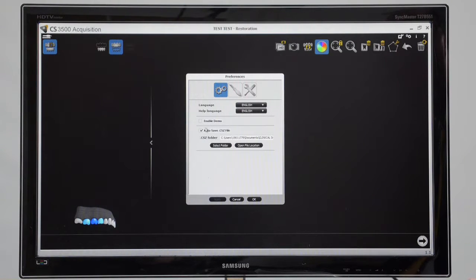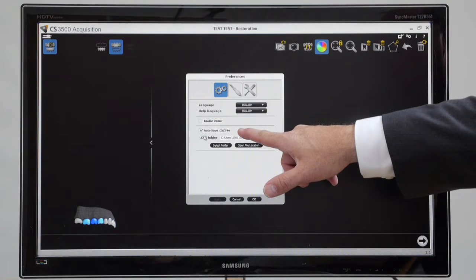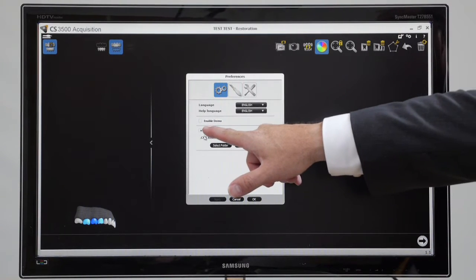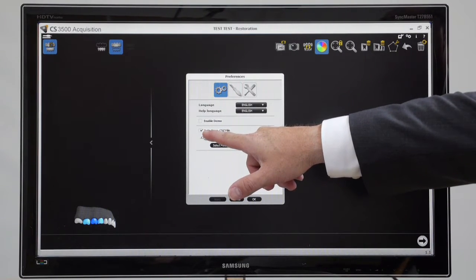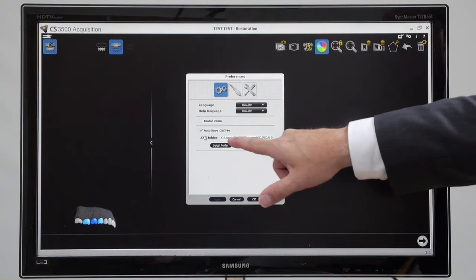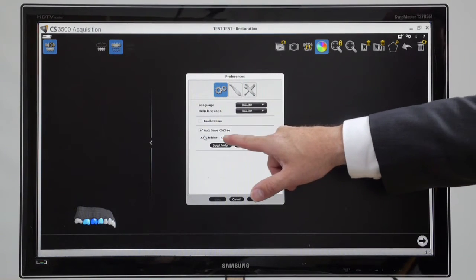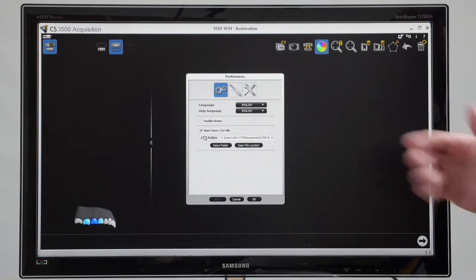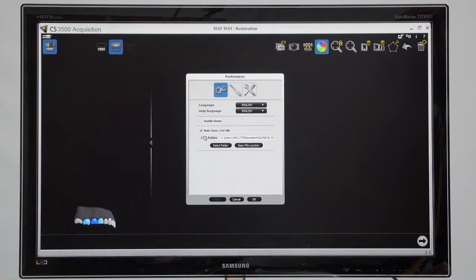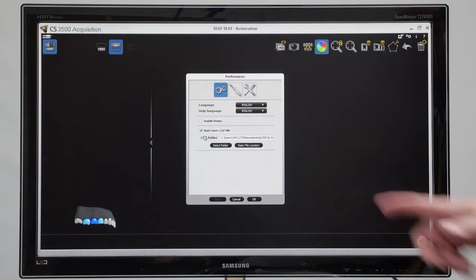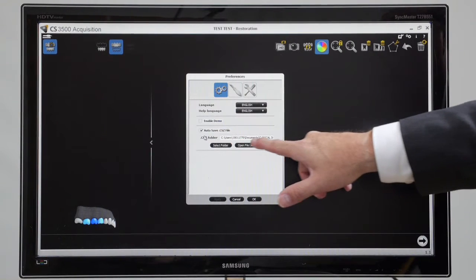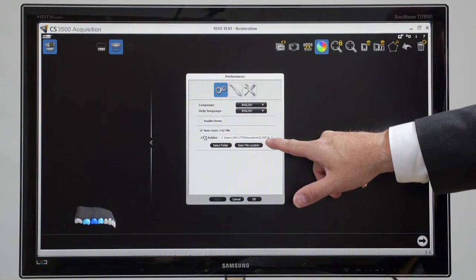The important thing I want to highlight is this auto save function. Please make sure that this is always ticked. And here is the directory that you can choose to save all your digital scans to. So you have free and auto digital study model storage by ticking that box and selecting your folder.